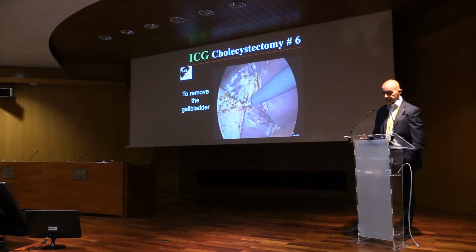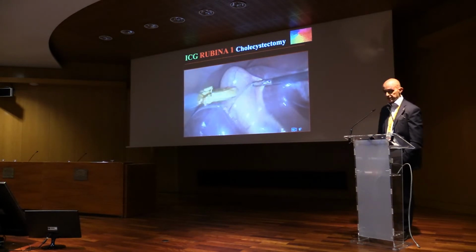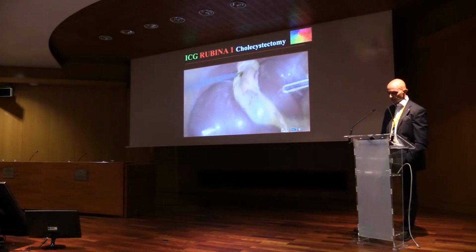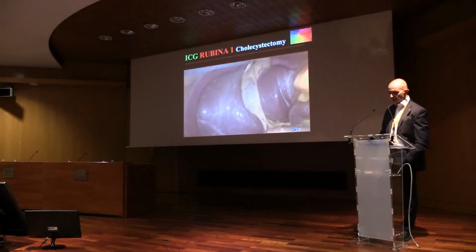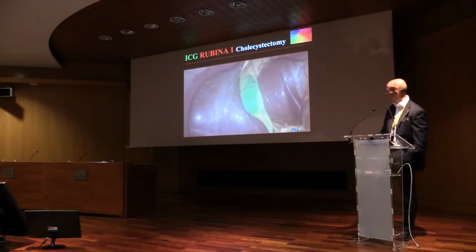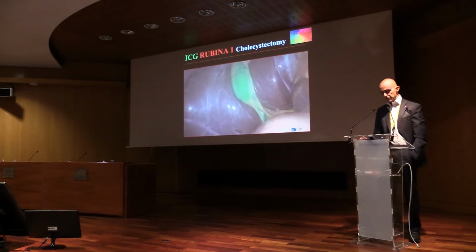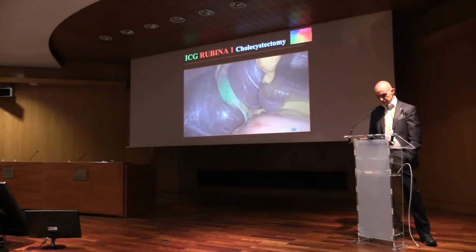Next. And then there is the new technology. With the new technology, with the Rubina system, you can remain working in color, pushing the button on your camera. You have the biliary tree that becomes green, and you can work in color, and for sure it's easier, and you can keep all the time the ICG view as you prefer. Next.